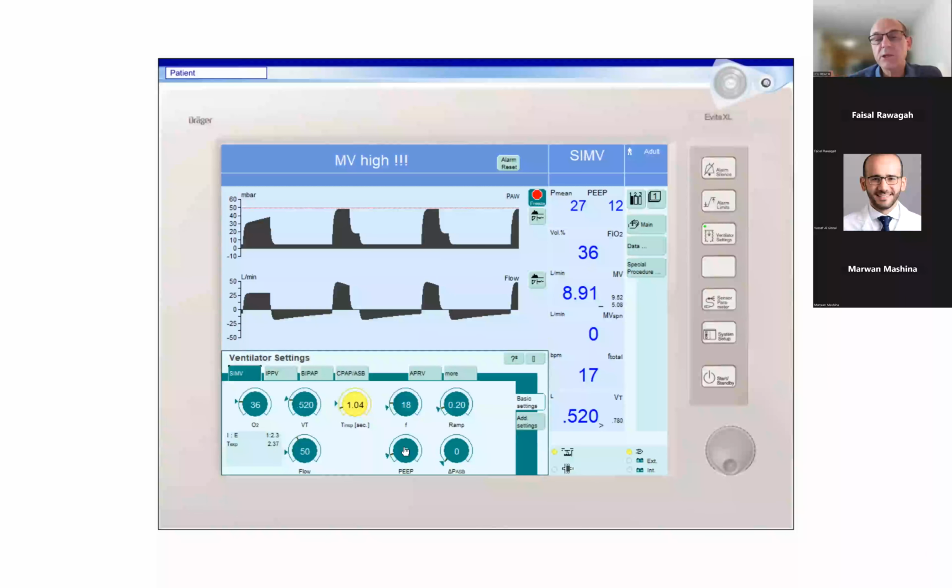Okay, excellent. So you're exactly right. We are controlling the inspiratory time, so the cycling mechanism is the time here. So you increase the flow, you can deliver the volume faster, but since we did not change the inspiratory time, all we got is we got the plateau back. So in fact, we created the same situation as how we started.